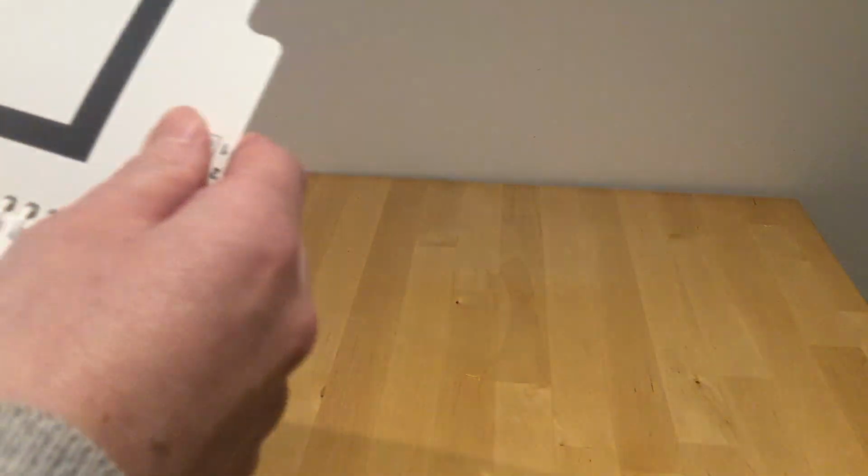So remember, we're doing this at 3 meters, so on the opposite side we've got the largest symbol. So I'm just going to flip it over and I can see, yes, that's looking pretty large. So that is what the child will see from 3 meters. We've got the house and the truck. And you can use that same key card as well.